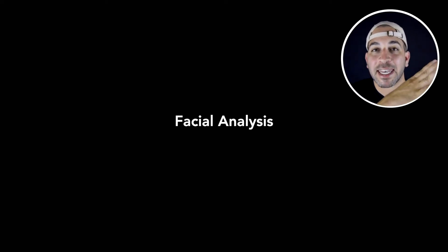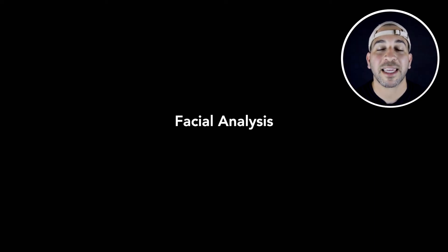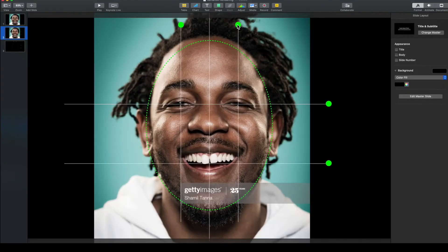So the first step is facial analysis. And this is where you take facial parameters to allow you to create a very natural looking smile design for Kendrick Lamar. Everyone has a different facial structure and these parameters will change accordingly. But this is how we do that.